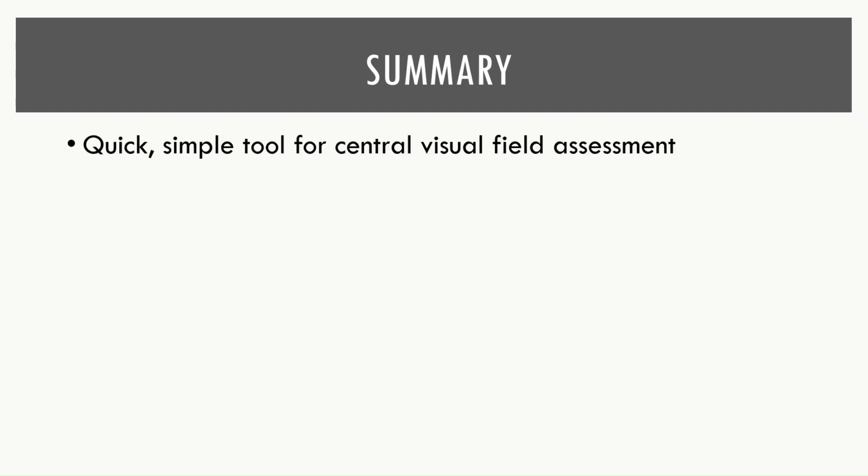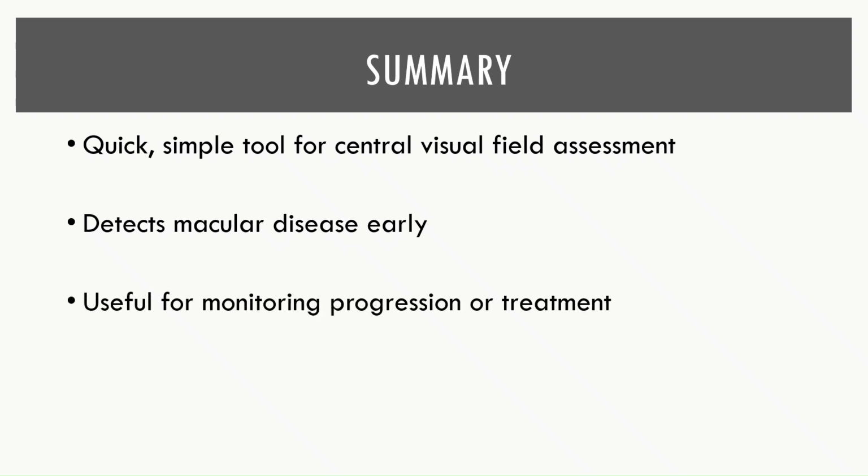In summary, the Amsler Grid is a simple yet effective tool for detecting and monitoring macular disease, enabling early intervention and better patient outcomes.